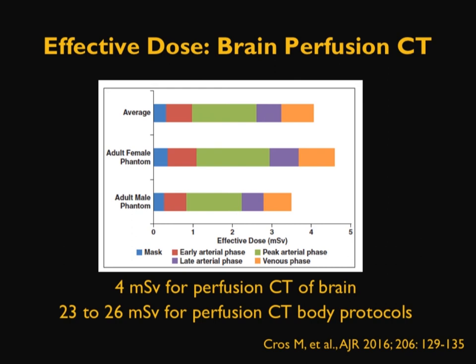More than the effective dose in perfusion CT, one needs to watch the surface dose, such as the CTDI-vol or the DLP as indicated here, which can provide an indication of the surface dose, which is an indicator for early transient erythema, epilation, and so forth.